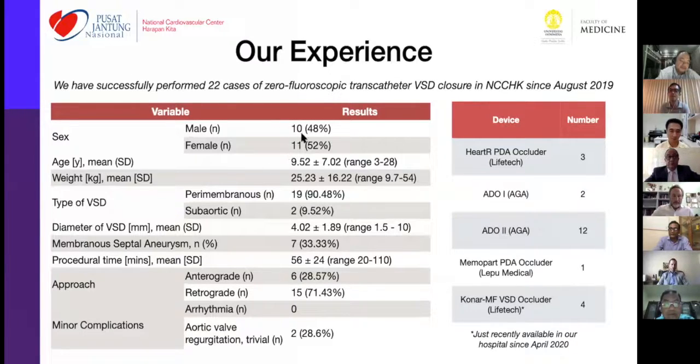We did several patients, and most of them still used the ADO2, because the Konar MFO just arrived in our hospital only 1 month ago. In that 1 month we started the MFO and did 4 VSD closures with zero fluoroscopy.